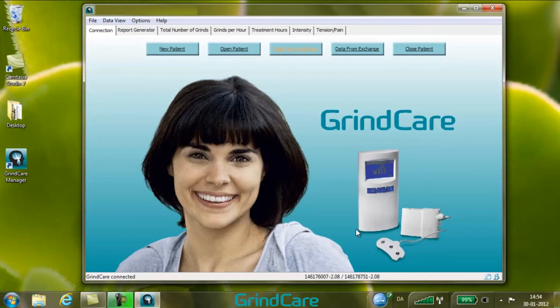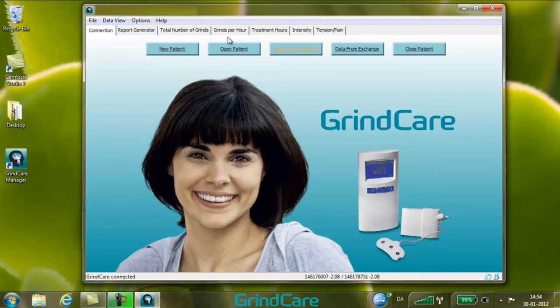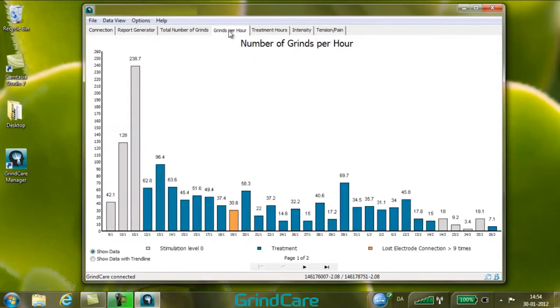Six more tabs can now be seen to the right of the connection tab. The first tab is the report generator. The following five tabs each correspond to a specific bar chart: total number of grinds, grinds per hour, treatment hours, intensity, and tension pain. A specific bar chart, for example grinds per hour, can be displayed by selecting the appropriate tab or by selecting the appropriate menu item in the data view menu.